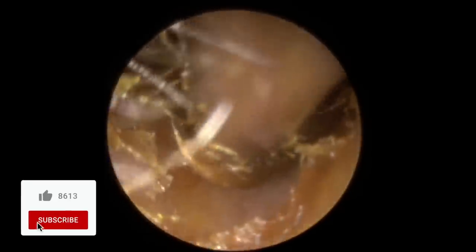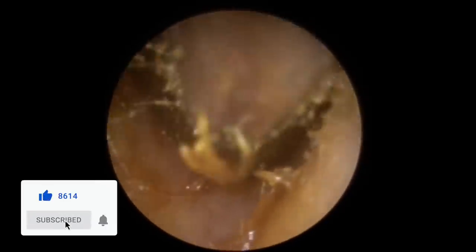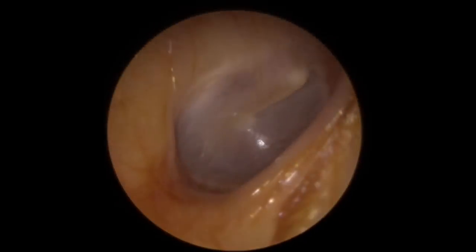You can see we've already started detaching it from the canal walls, so we're just going to gently manoeuvre this out now. It got stuck about halfway out there — let's get a grip on that. You can see it's really sticky because it's stuck to the outer part of the canal. Now we'll take a look — there's the eardrum there.